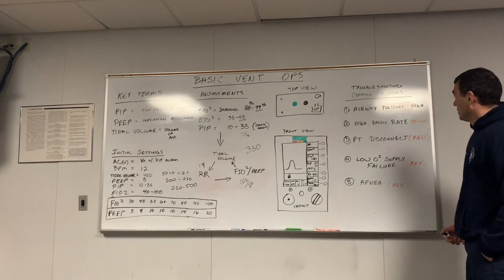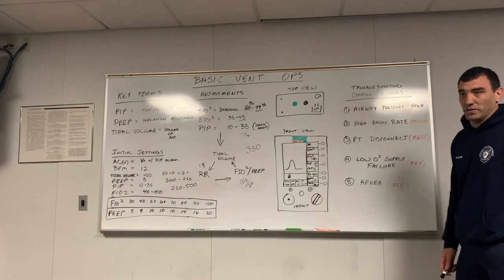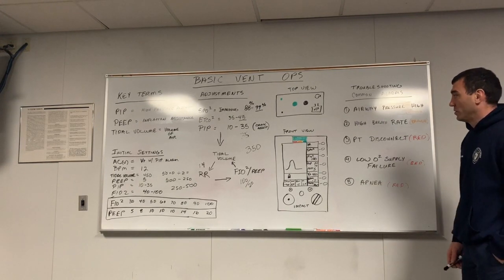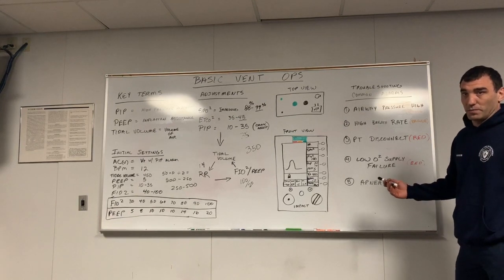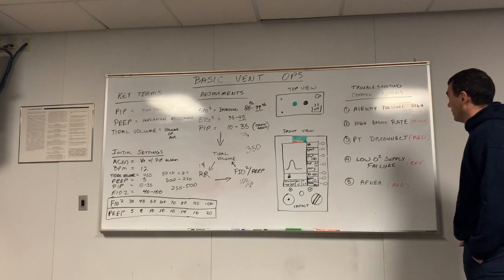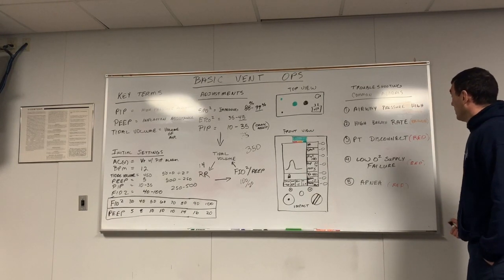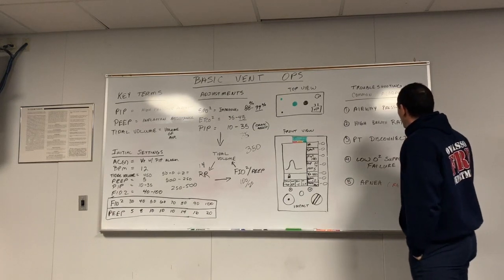Okay, so if you look at it, you're like, hey, my tidal volume is perfect. I know I don't need to adjust it. I'm right in the middle. I know I'm good, or I'm already on the low end. But I look at my tube and it's full of blood and throw up. That's the problem. Okay, I need to suction my tube. Okay, the obstruction in the tube is causing that. Airway pressure high. What's the last one?